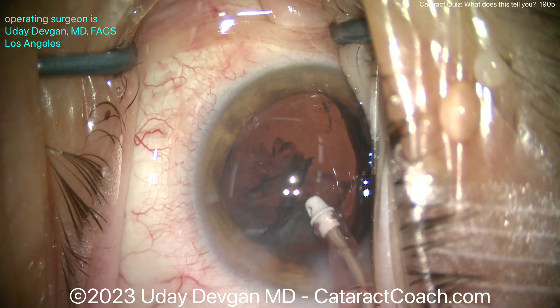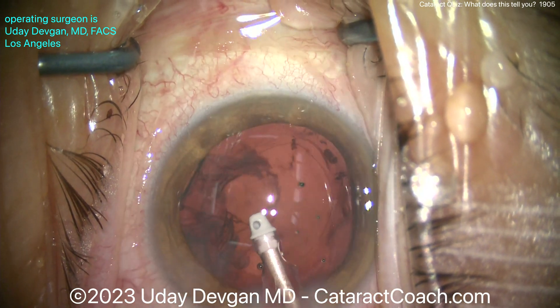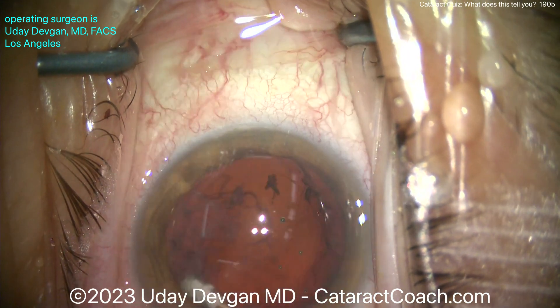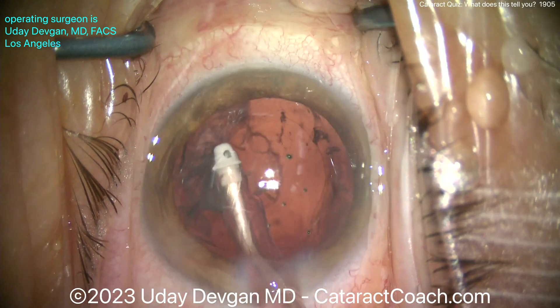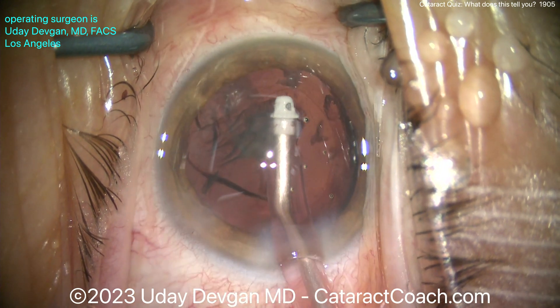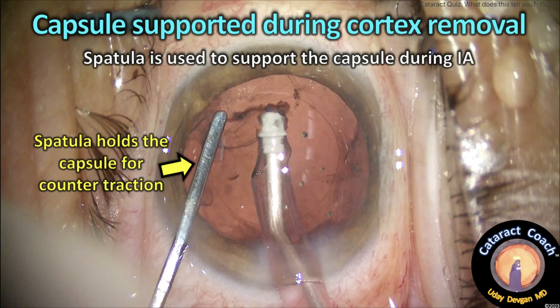We're going very slowly here to remove cortex, nice and easy. I'm doing it in the areas away from the zonular loss. The pieces come up, and again look how slowly I'm taking it. Now we're coming near that area — oh, there's the equator again. So let's not touch that; let's try to get some of the cortex here. As I start to pull, I'm still feeling the equator again — I don't want to keep pulling here.